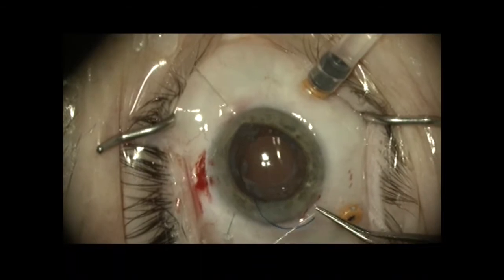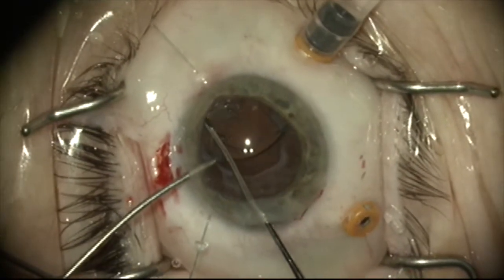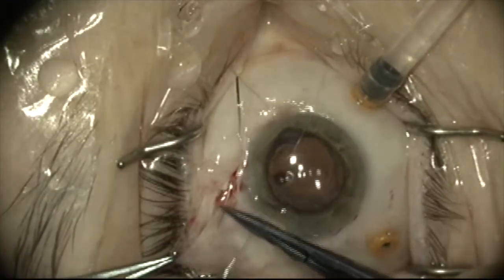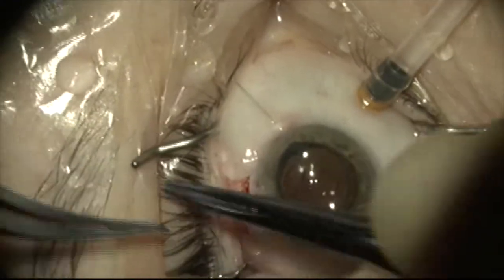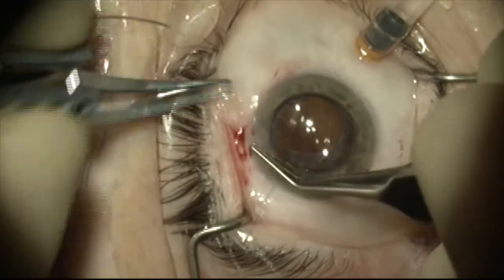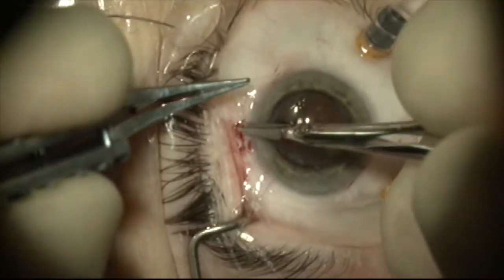Here I'm tying the 9-0 prolene to the remaining haptic. I'm now going to dial the lens into position and suture the 9-0 prolene to the base of the scleral flap, where it will be covered by sclera and conjunctiva. I pass the suture through the base of the flap and I'm tying it to itself here and adjusting the tension so that the lens is nice and centered.